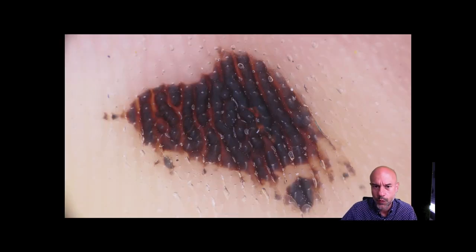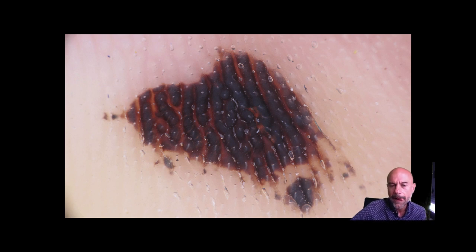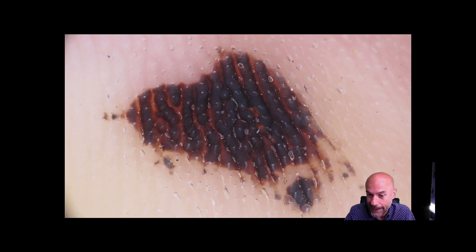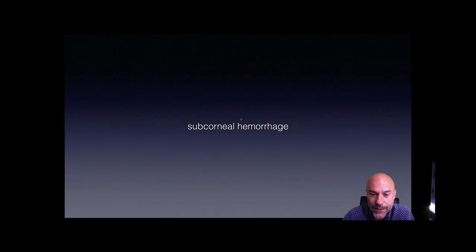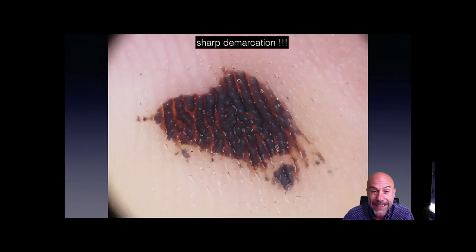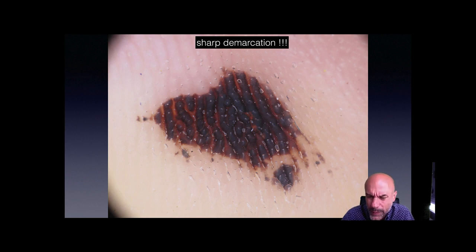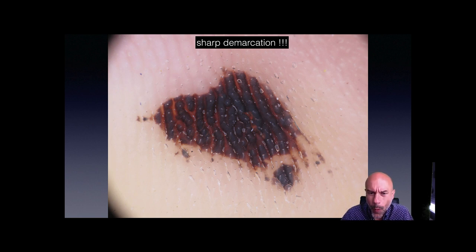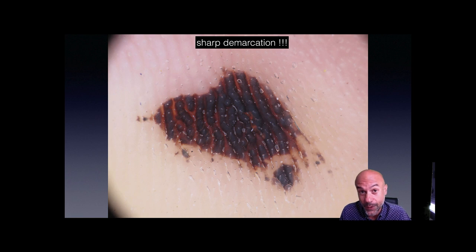In the next image, we can see a quite similar pattern that looks rather like a parallel ridge pattern. But this is not melanoma — this is a hemorrhage. We can say so because of the red color, and mainly because of the very sharply demarcated outline of the lesion, and also because of the presence of satellite hemorrhages not connected to the main body of the hemorrhage, which reveals that this is simply blood. Subcorneal hemorrhage is the most frequent cause of pigmentation of the soles.